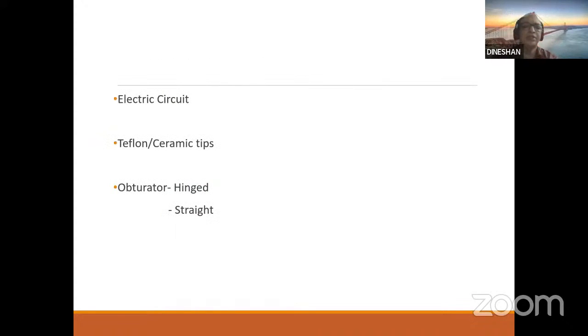Now, in a TURP circuit, how is the circuit completed? You have the electrical system coming up.